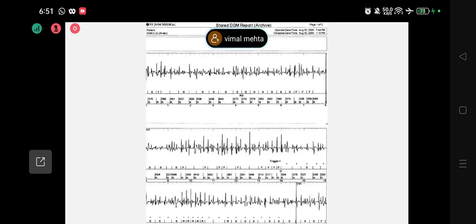So why was the ICD firing, giving repeated shocks and considering that the patient is having ventricular fibrillation? Rate was very high. So it was sensing multiple signals as R waves at VF rate. Beautiful answer. So oversensing.